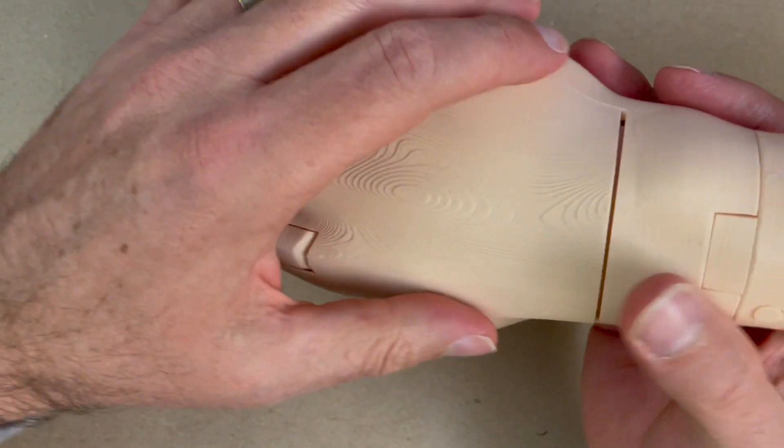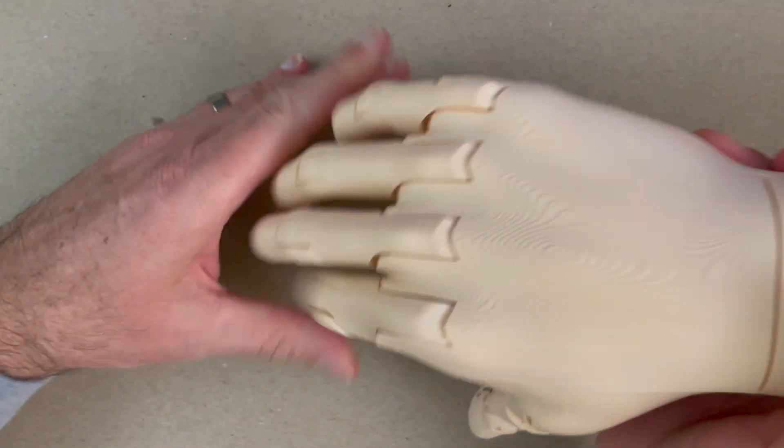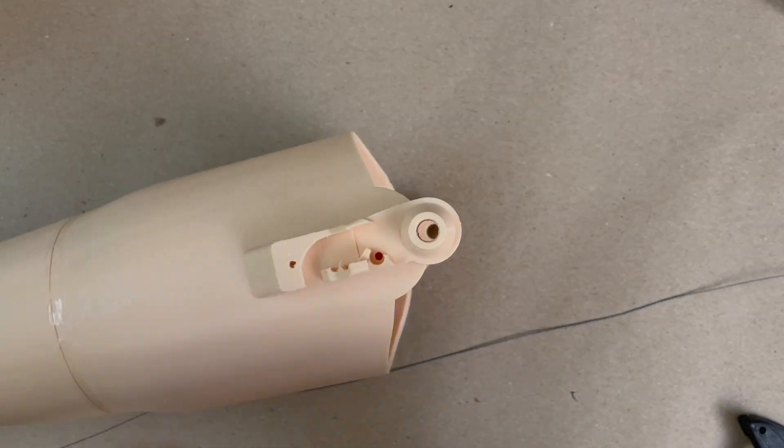I want to make sure all these fingers move nice and clean. If they don't, worst case, I've got to take it apart and sand things down a little more. But they should move really easy and clean.